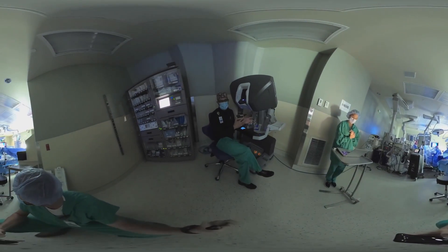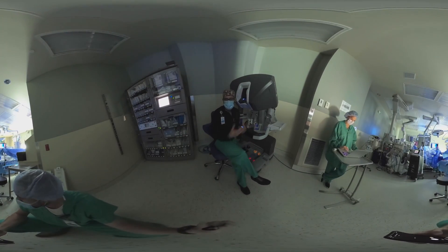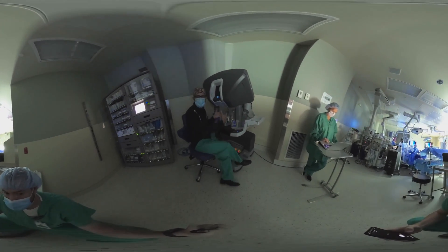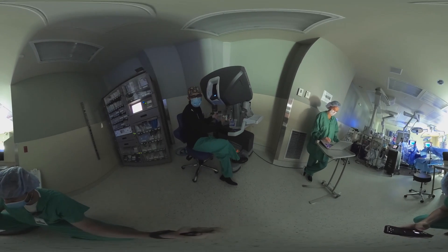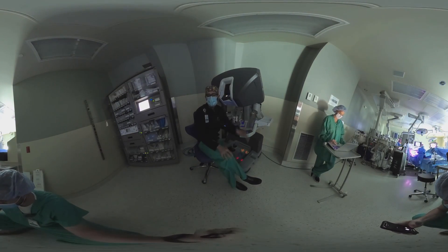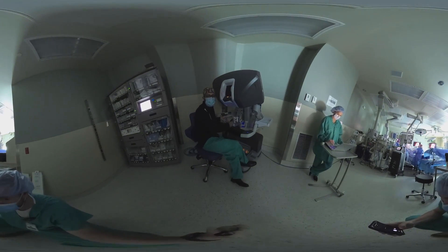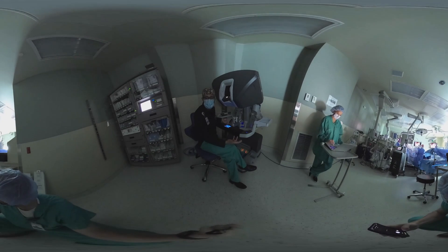The robot is easiest to think about as almost like operating a crane. There's a series of levers and pedals used here at the robot console that translate into motion on the actual effector on the robot side connected to the patient. So all the motion that I do here is translated into action inside of the patient's body.